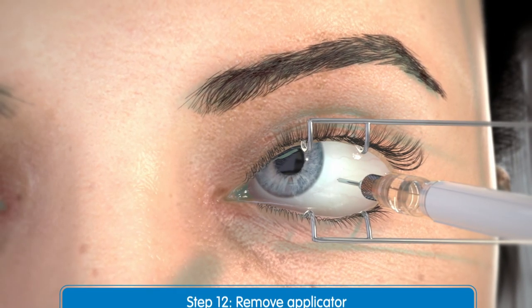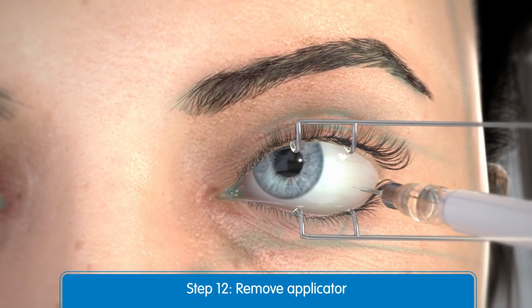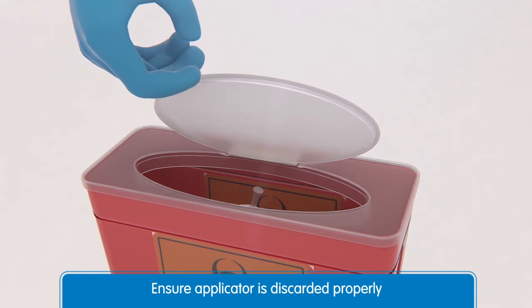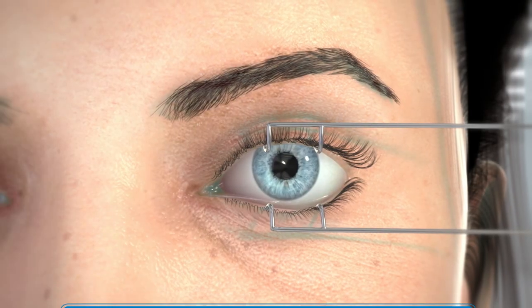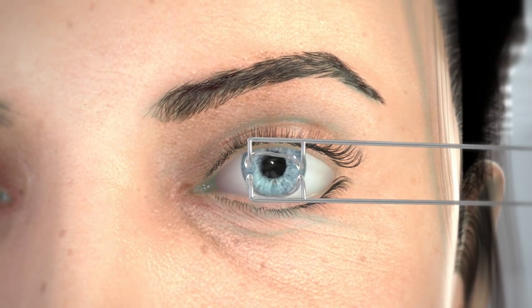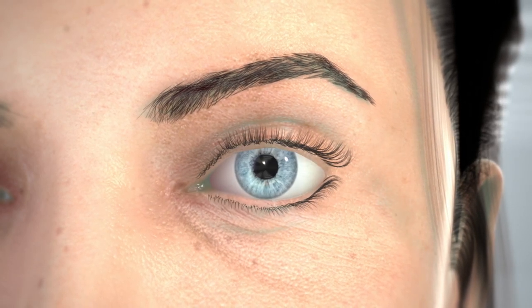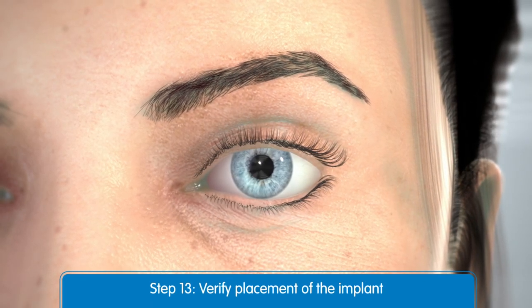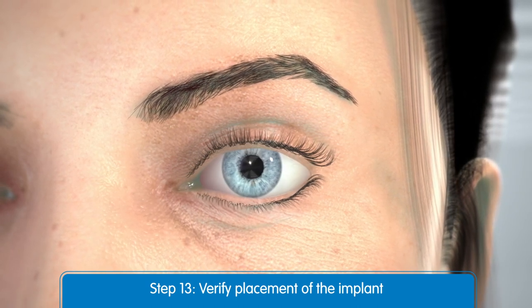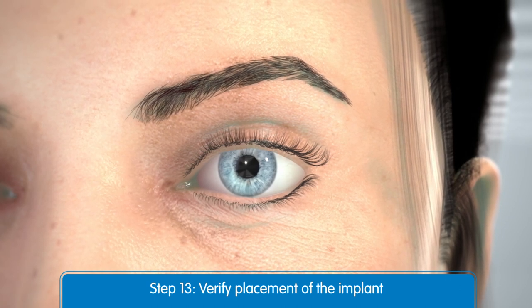Now that the implant is complete, remove the Utique applicator from the eye. Discard in a biohazard sharps container. Now you can remove the lid speculum and perform indirect ophthalmoscopy to verify adequate central retinal artery perfusion, absence of any other complications, and to verify the placement of the implant. Note that scleral depression may enhance visualization of the implant. You may perform a test to measure intraocular pressure at this time.